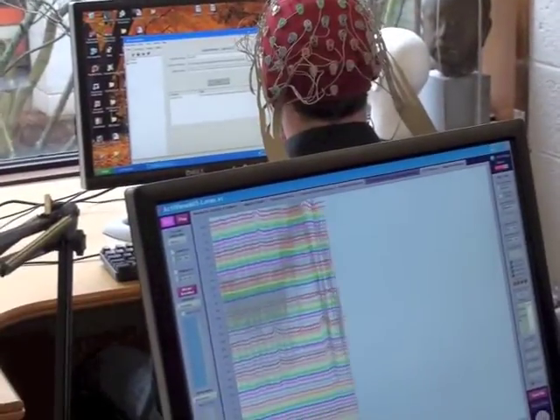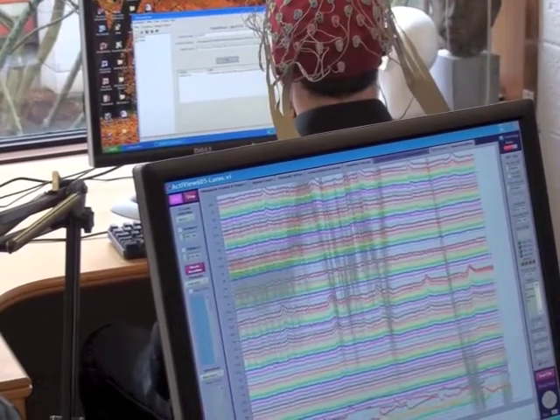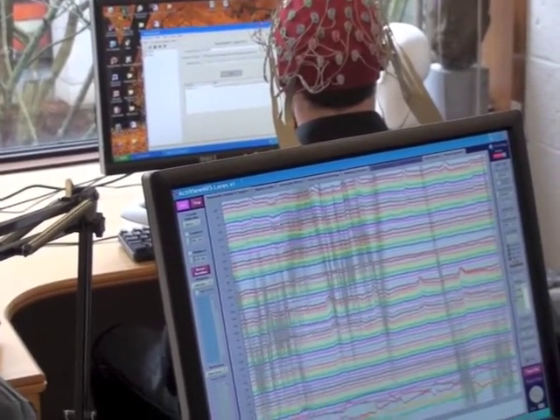Helen, can I just say about the blue light? Is that directly related to just the CMS DRL? So what happens if it doesn't go? No, it's just that I have everything connected.